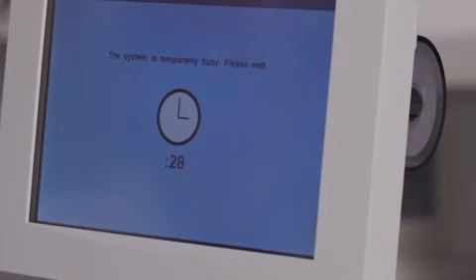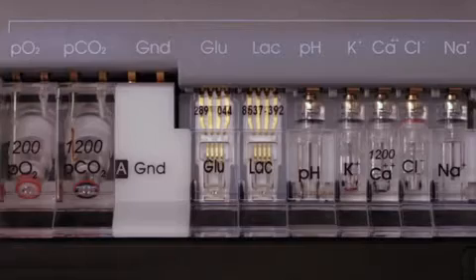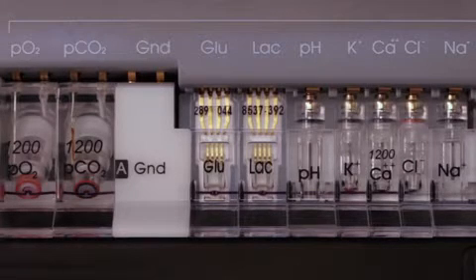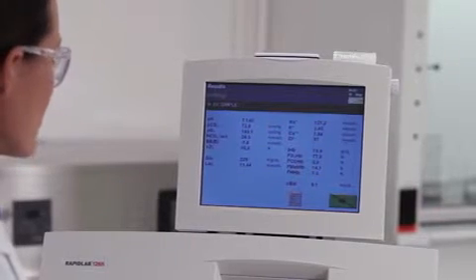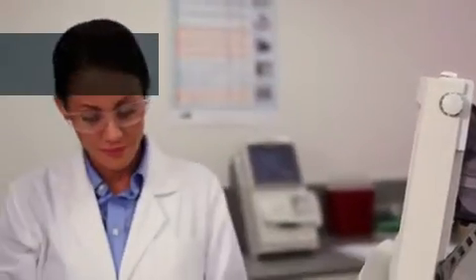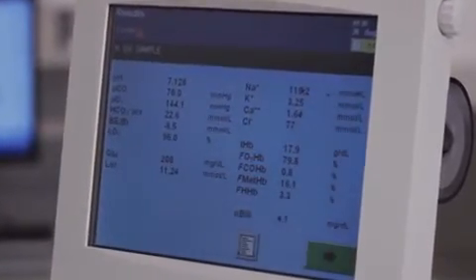Heparinized whole blood is automatically aspirated for analysis. The blood is clearly visible in the measurement chamber, so the operator can monitor sample integrity. Results are displayed and printed in 60 seconds, and if connected, are automatically sent to the LIS blood gas or the Siemens RapidCom data management system.